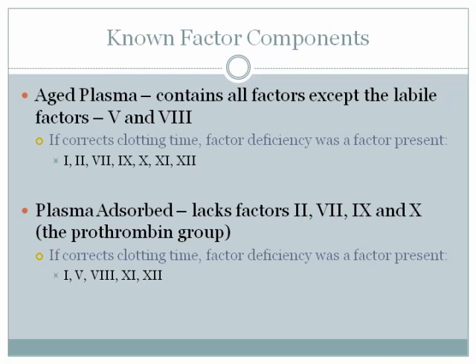All right, let's look at our next one. Prolonged PT, prolonged APTT, no correction with serum, it corrected with aged, no correction with adsorbed. I always think these are kind of fun to do.